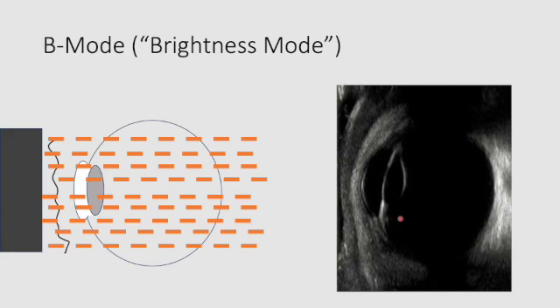Same thing, we don't have any echoes within the vitreous because there's no boundary changes, but the second that all of those waves hit the retina, we get a strong signal with some posterior acoustic enhancement, or some posterior echogenic enhancement. And I think that's one of those artifacts that we talked about as well.